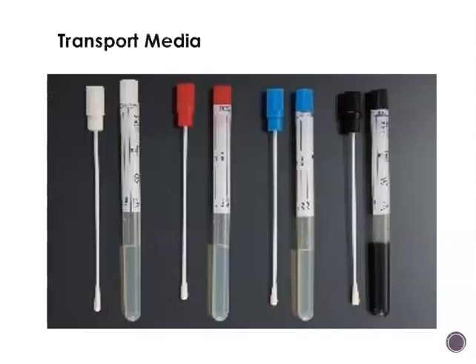Okay, and here's just a few pictures, a few examples of some different types of swabs that can be used. You can see in the bottom of each of these tubes here, there's a gel. So that's the preservative. The one on the far right here is charcoal. So that charcoal that's in the media, again, it just helps remove some metabolic byproducts from some of the bacteria. So just a few examples there.